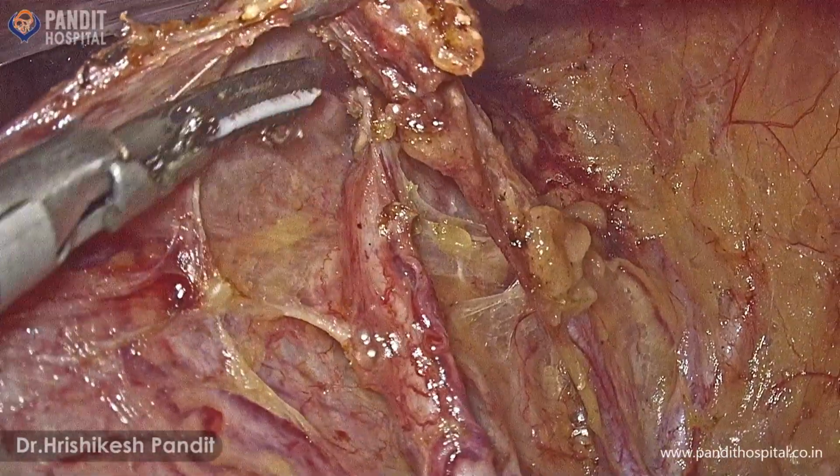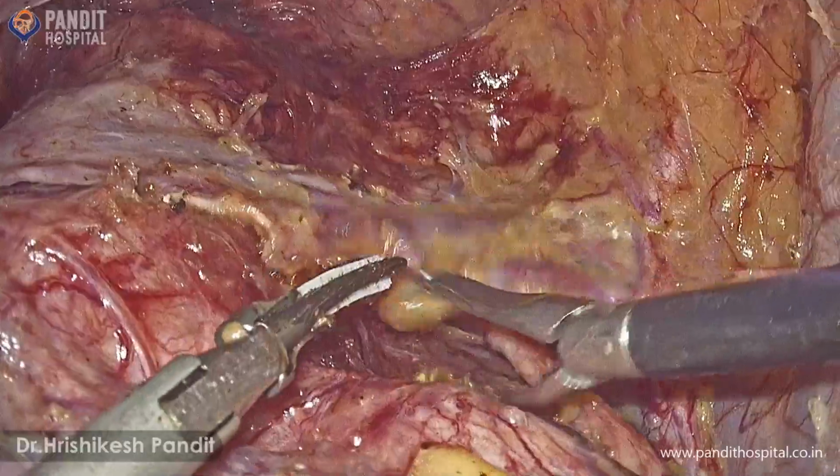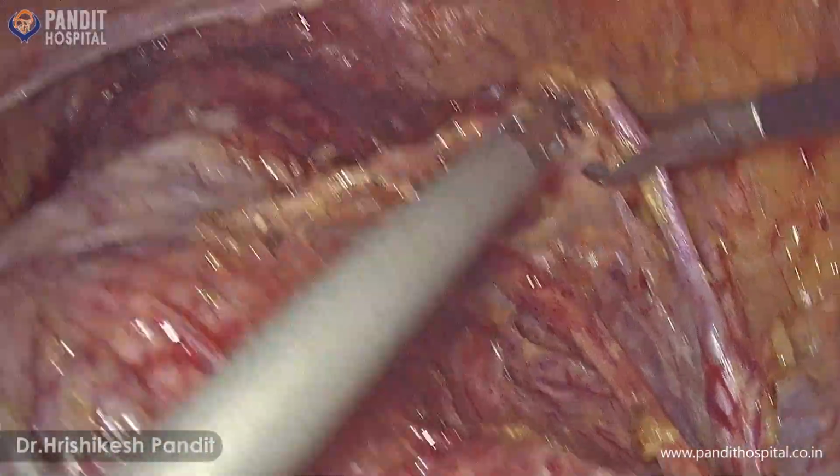The assistant is retracting the uterine artery and we can see the ureter crossing under it, known as the water under the bridge.